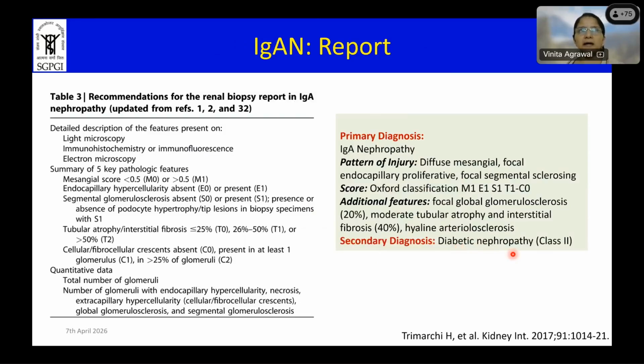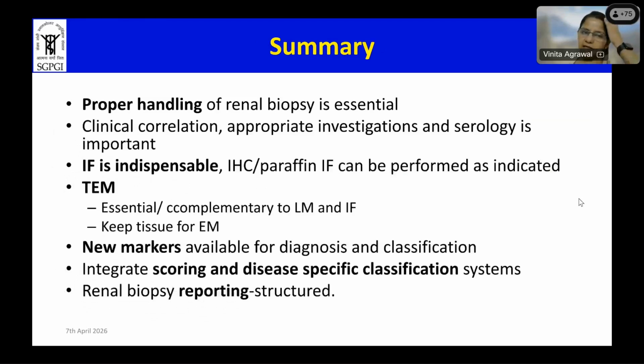So that is how, as a renal pathologist, you need to look at all the 4 compartments and always remember that there may be multifactorial things going on in the renal biopsy. So this is the summary of my presentation. I will say that the renal biopsy should be properly handled. Never touch it with a forceps. Always touch it only with a brush.